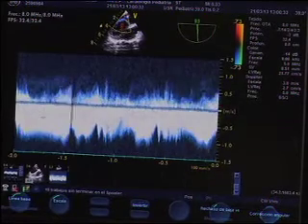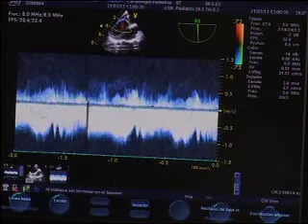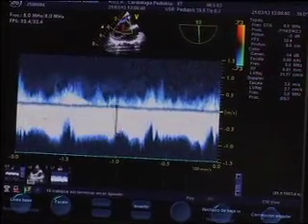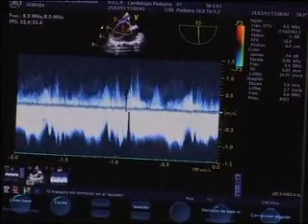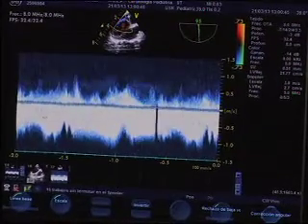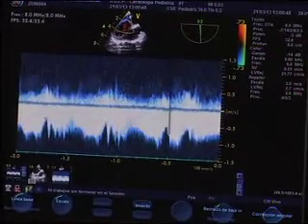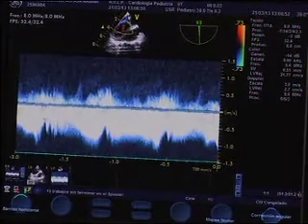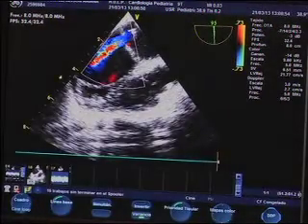I guess that is the real problem with static balloon dilation, that it often just gives a partial relief rather than a complete relief of interatrial gradient, and then makes it more difficult if you were to try and come back and want to put a stent in here, because it'd be difficult to know what size stent would actually hold.